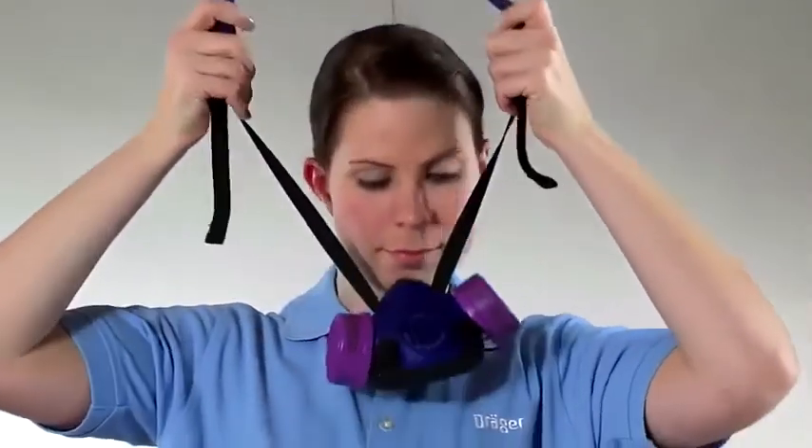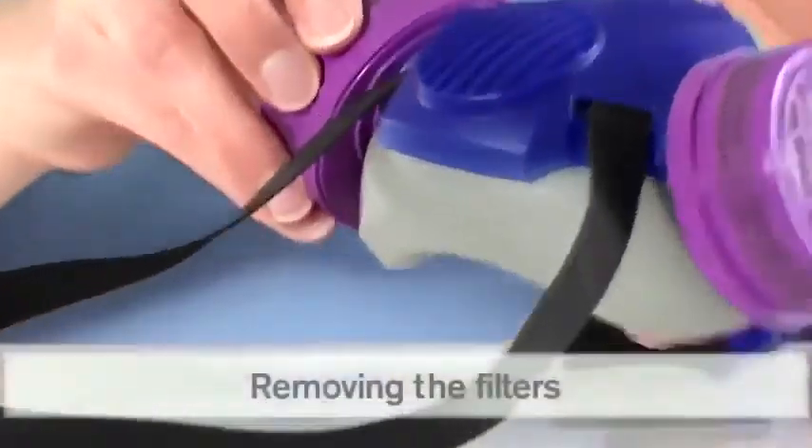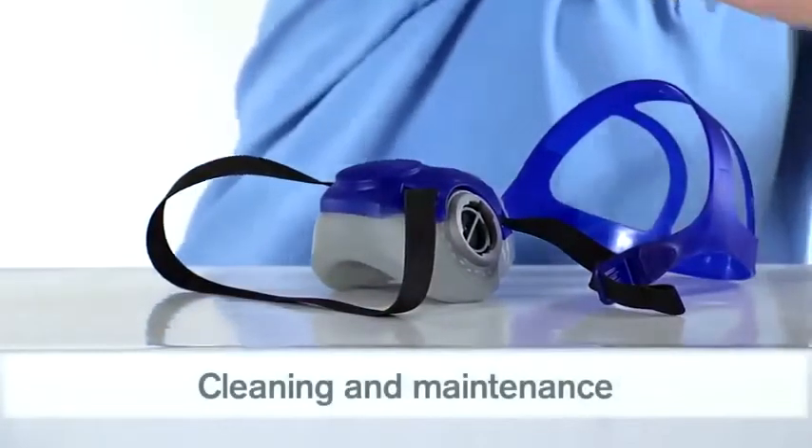To doff the mask completely, pull the harness from your head. Before cleaning the mask, remove the filters and disassemble the mask. Please make sure to review the maintenance intervals stated in the IFU.